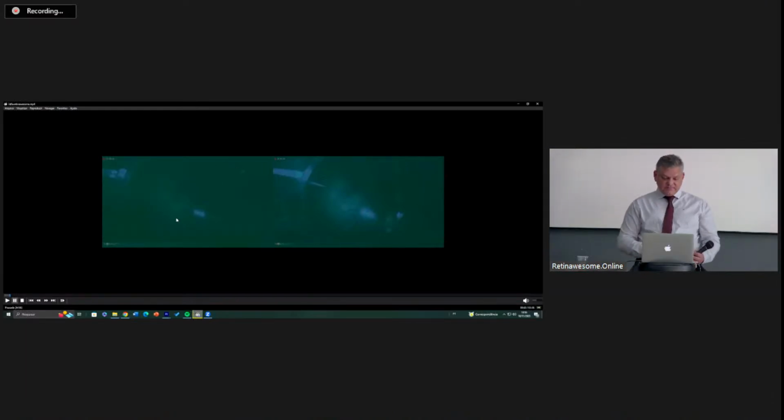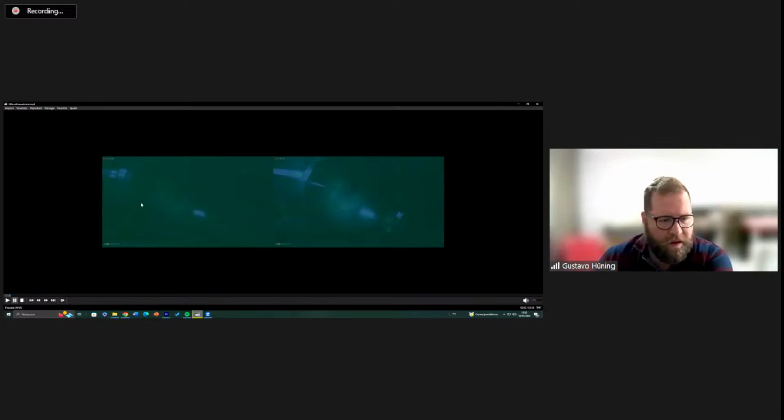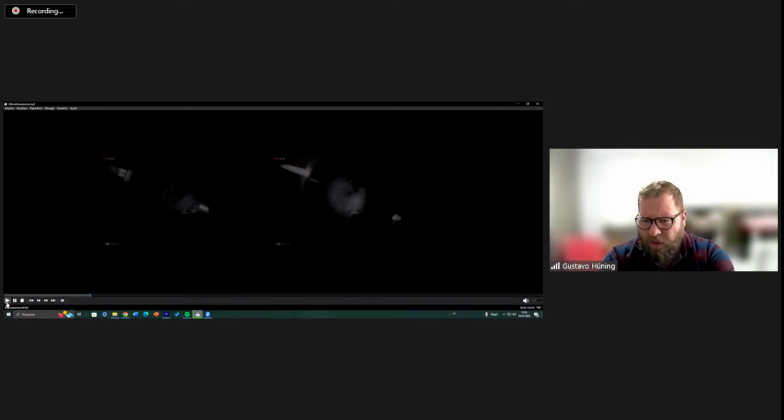Full screen. So this is a case we presented a year ago during the VitreoRetinal meeting in Rome, when we started with Alan to develop the technique. I'll pause here. You'll see that the right eye and the left eye are different, because on purpose we left the barrier filter in just one of the optics of the angiography camera. On the right side it's much brighter because we are not filtering most of the light. On the other hand, at that time we were still learning. On the left you get better contrast, and I think nowadays the black and white filter is the best solution for these cases. You can see the ischemic areas and the aneurysm there.